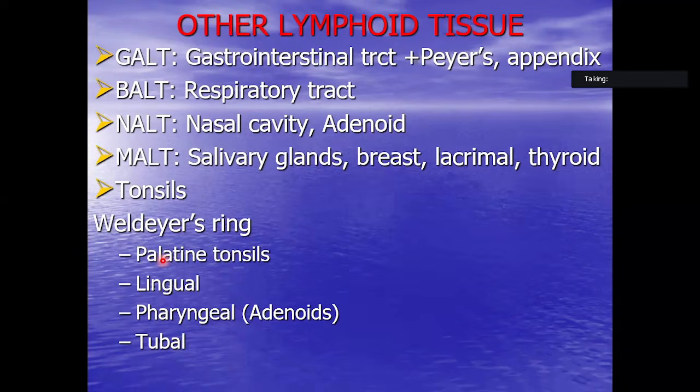Associated with tonsils, first we have stratified squamous non-keratinized epithelium, as in the pharynx.